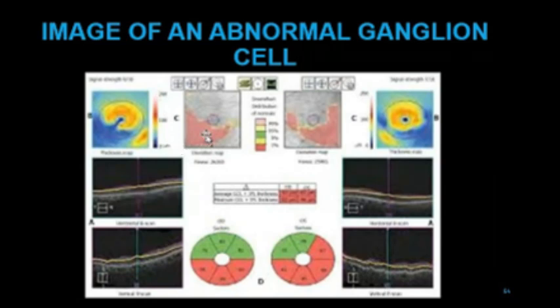And then remember I told you that the color coding for this and this are not the same. The color coding for the deviation map and the actual map are not the same. They are opposite. In this place, red means normal. In this place, which is the deviation map, red means abnormal. But if you note, the pattern here is the same pattern here. Have you noticed it?